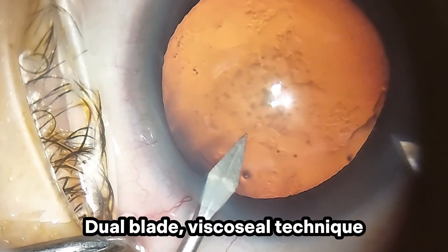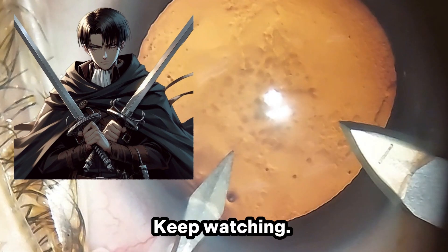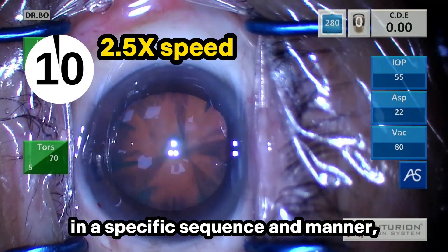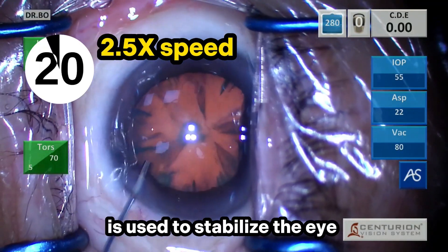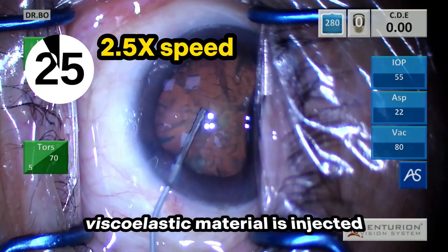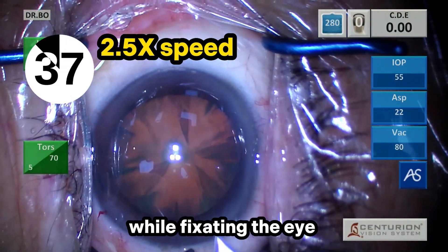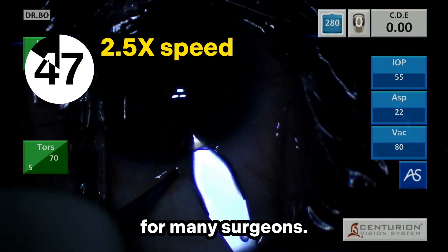Dual blade viscocelle technique. How can I safely shorten my operative time? We are all familiar with making corneal incisions in a specific sequence and manner, where a fixation ring, q-tip, or forceps is used to stabilize the eye while making the side port. Viscoelastic is injected into the anterior chamber and the main incision is then made while fixating the eye with the other hand. These steps may take more than one minute for many surgeons.